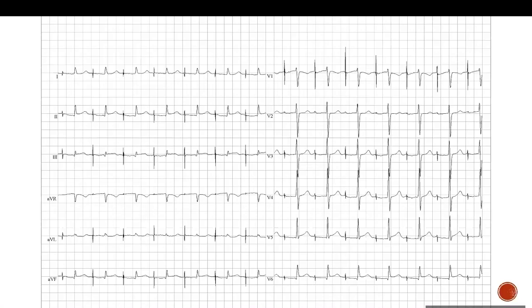When you're programming the pacemaker, you could set it to work as AAI, and once there is a dropped QRS, it will switch to DDD to pace the ventricle. Another way of doing that is extending the AV delay. You could extend it up to 300, 350, and in some devices up to 450, which allows the intrinsic QRS to be there.